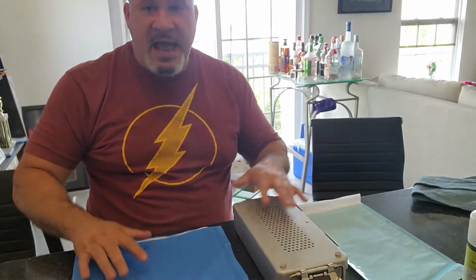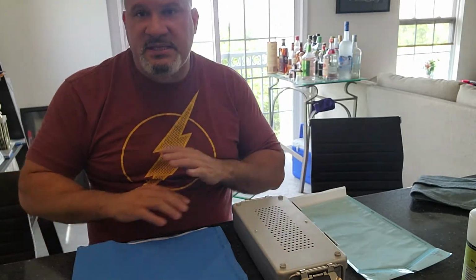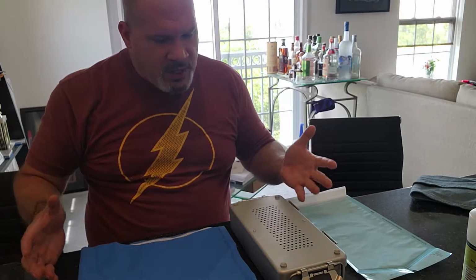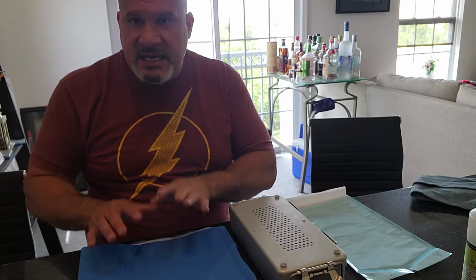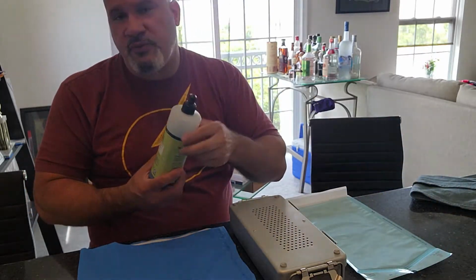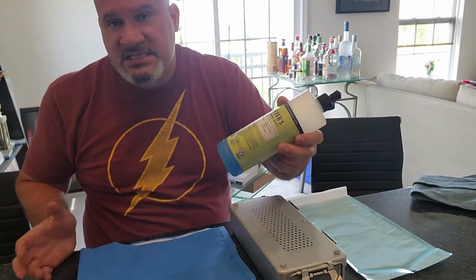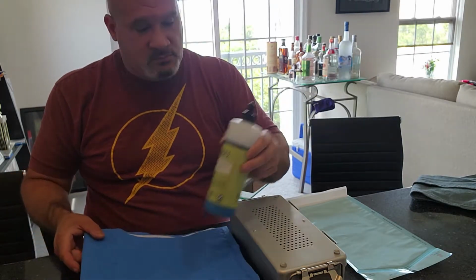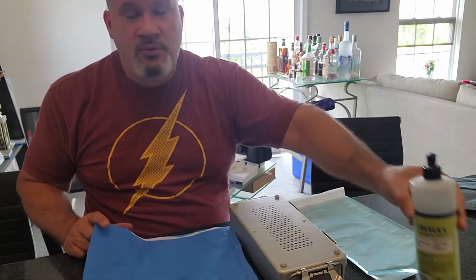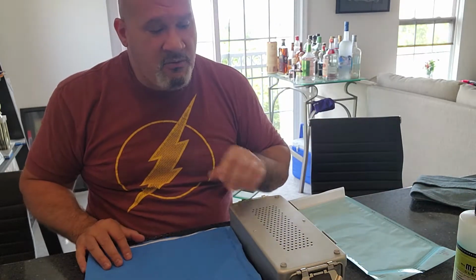What I have here are 3 packaging systems, and I'm only going to speak to steam, guys. I'm going to speak to the other ones briefly, but not all the way. But how do I know if an item can be placed in a wrap, container, or a peel pack? I use something off the wall. Of course, this can't be steam sterilized, but let's say it could. It fits in here. It fits in there. It fits in there. So I can choose whatever I want, right?